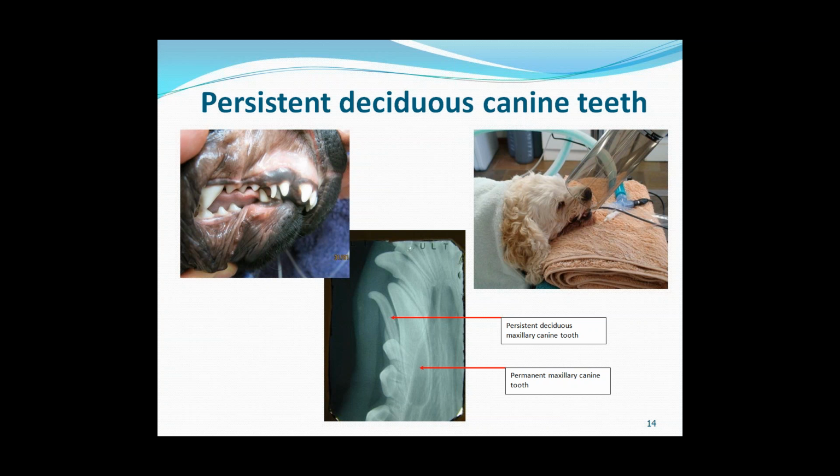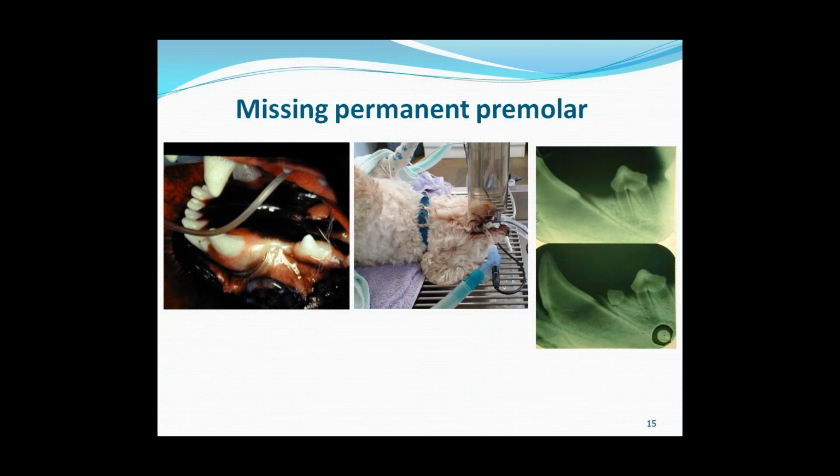So when you actually extract it and only half of the tooth is removed, because of the radiograph you can determine whether you need to go back and actually remove the other half of the tooth which may be left behind. So if the tooth is half resorbed and you've only removed the resorbed part, then on the radiograph you can determine that there was no more tooth there.